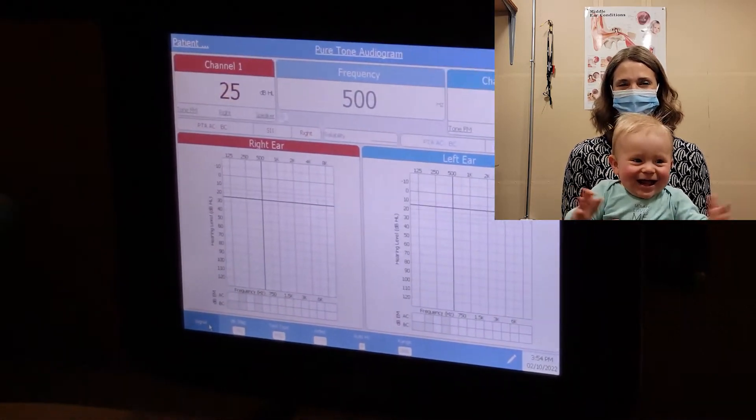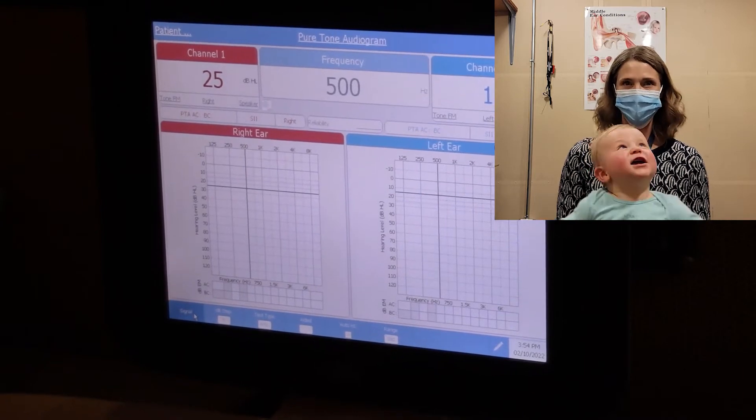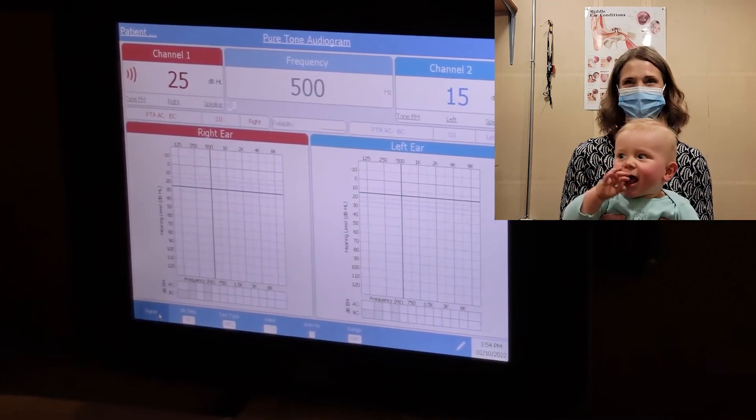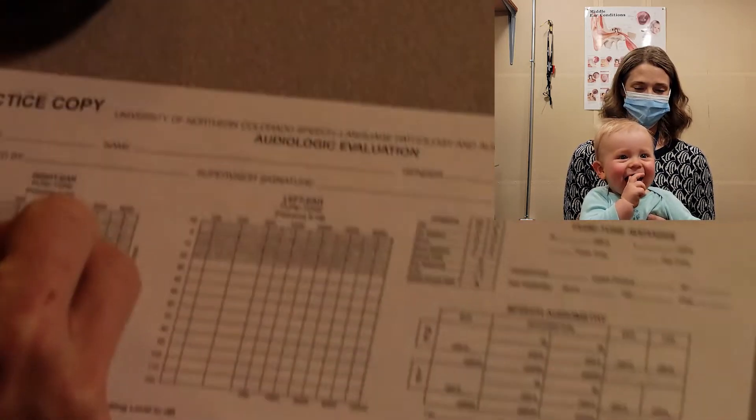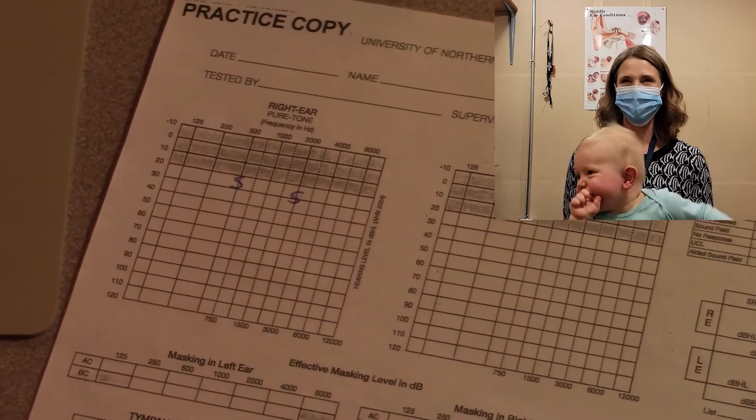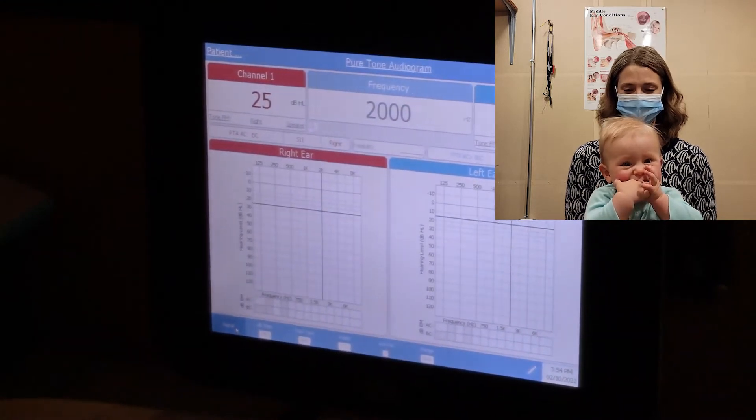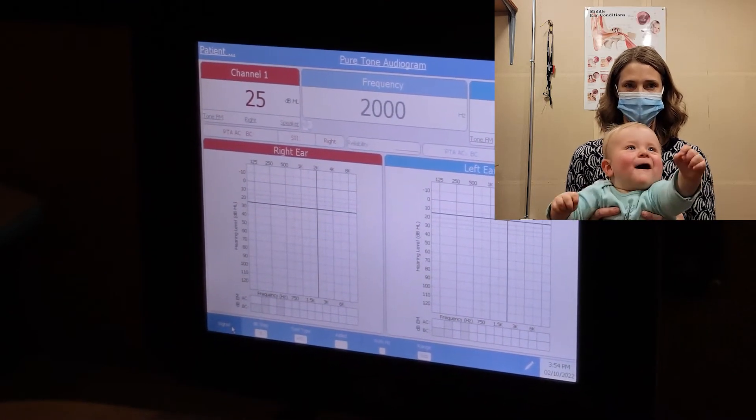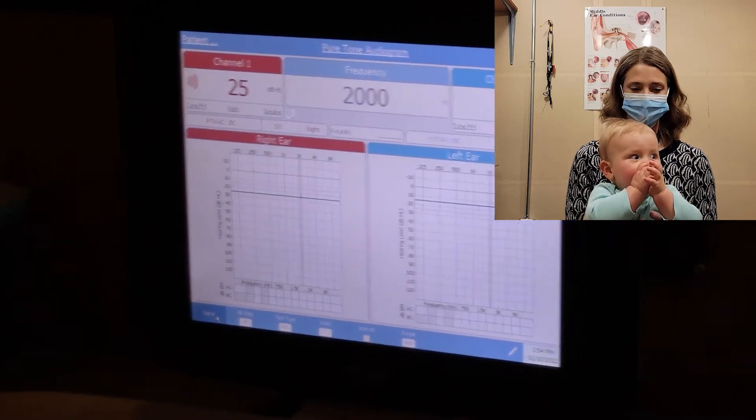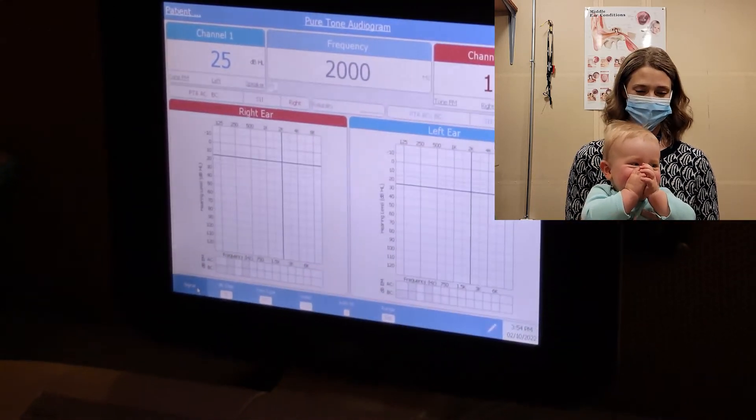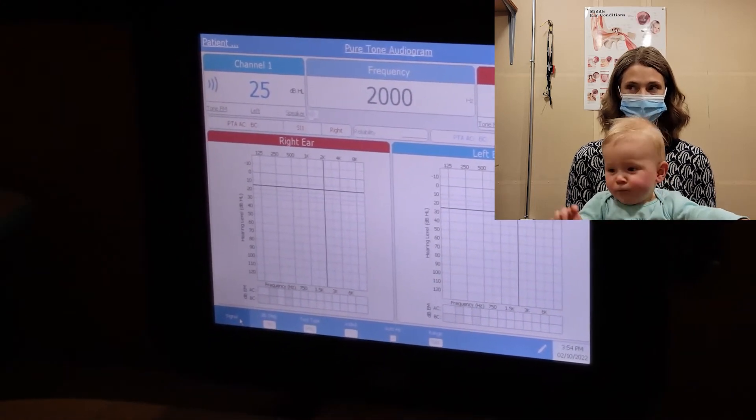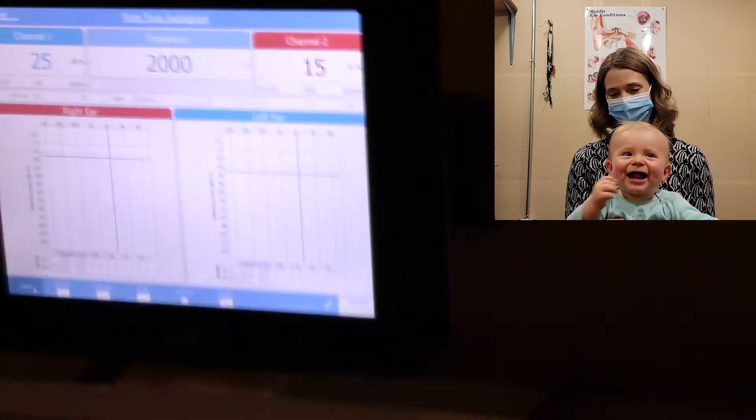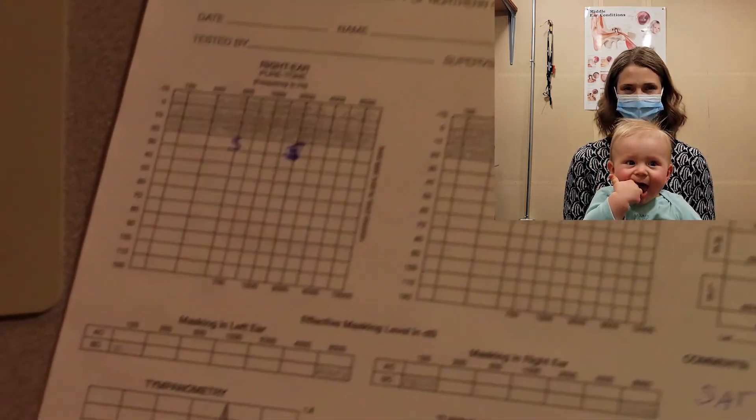So let's try right. To our right. Okay. So 25. I'm going to put 25 at 500. I'm going to call that good. I'm going to go back to 2,000 to see if I can get him. At 25, 2,000. I'm going to our right. There we go. And then to our left. There we go. So not totally direct there, but he was. So we had 30 before. We're going to take 25.